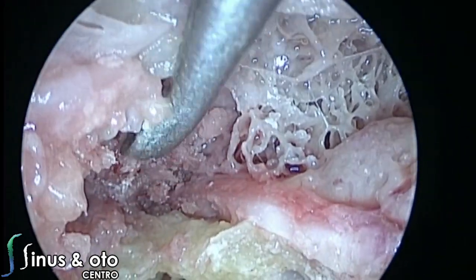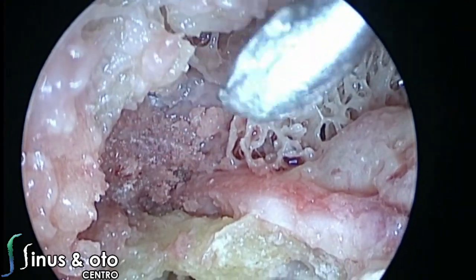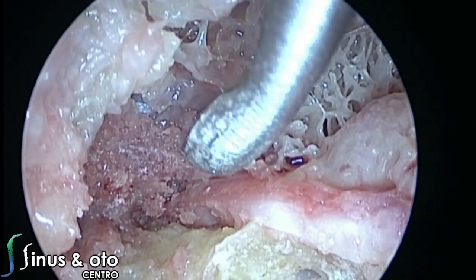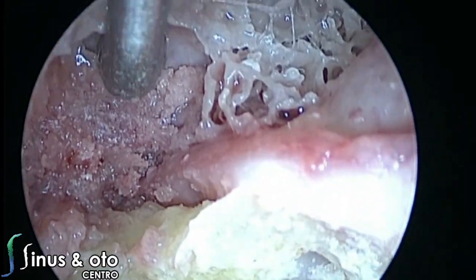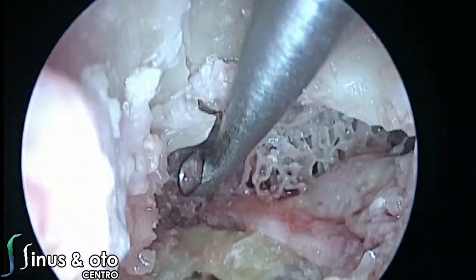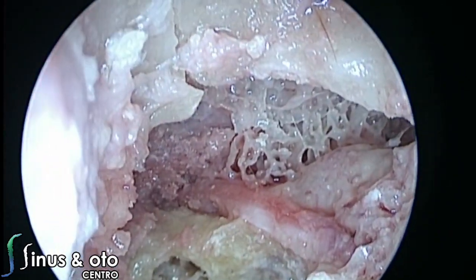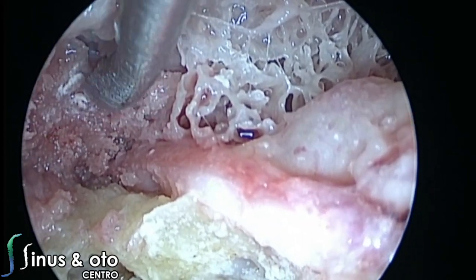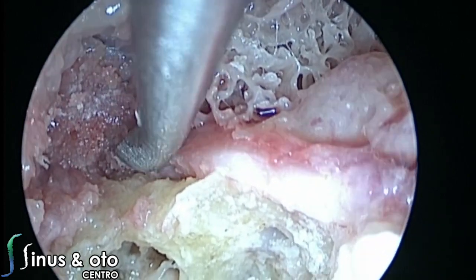So you have ways to follow the disease and ways to remove it, theoretically and in practice in some cases, avoiding bigger approaches. So we can understand here the relationship between the dura and the geniculate ganglion, just curetting here and trying to see the middle fossa dura located in this suprageniculate ganglion region.